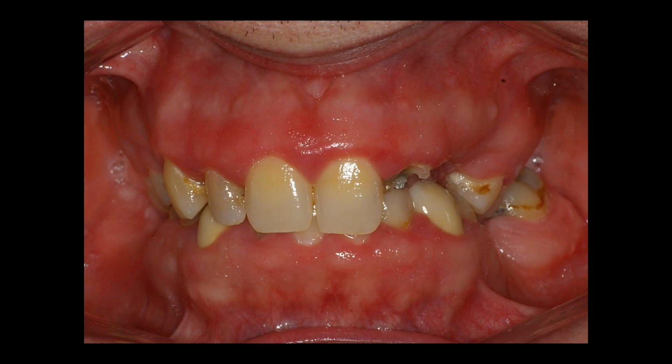We also saw that we knew that we had to raise this level, because the last thing we would want is the transition line in the aesthetic zone. In other words, when this patient is going to smile with implant therapy having a bridge, there's no way to mask that transition line unless you bring it above the aesthetic zone so that when he smiles, it's not apparent. And that's something that's very important that we teach at the Ascend Dental Academy.